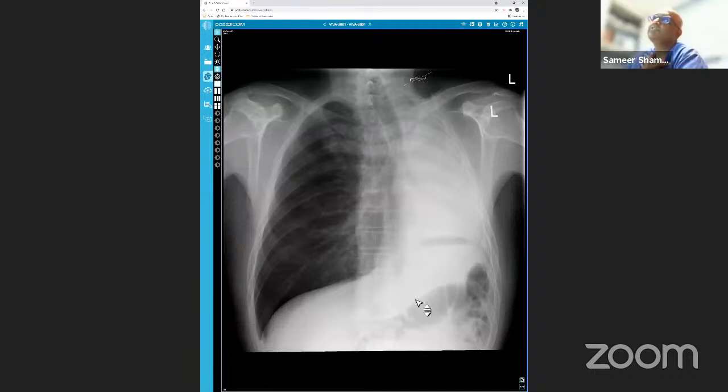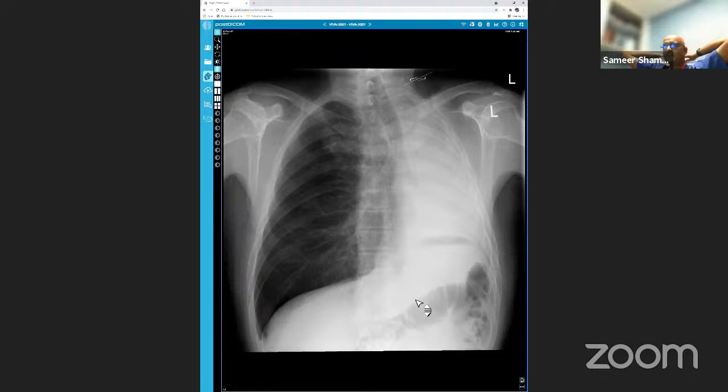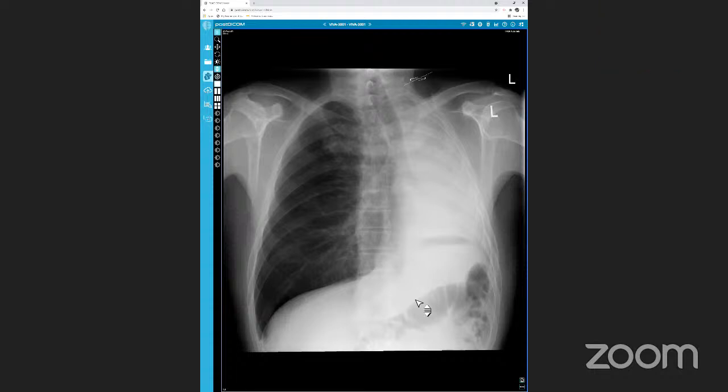When you say left lung collapse, is it like an acute left lung collapse? Do you mean suddenly the patient has got a whole lung collapsed? Yes, that is for a whiteout. I know the collapse of upper lobe, lower lobe or lingula. The whole lung collapsing, is it normal? No, it's quite uncommon for the whole lung to be collapsed. Unless, of course, someone has ingested a foreign body, which sits in the left main bronchus. That's a possibility, yes. I agree. There is a complete reduction in lung volume and there is whiteout. This is not pleural effusion because there is no mass effect. So what's happening to the right lung? The right lung is hyperexpanded.